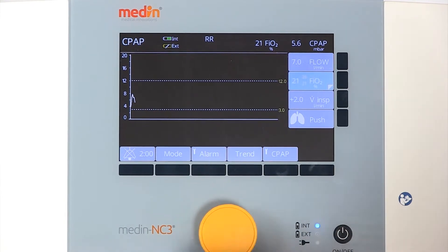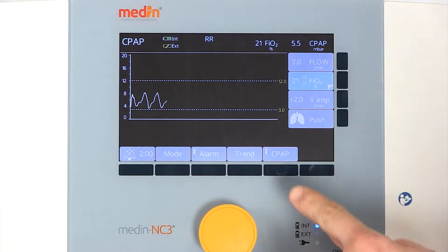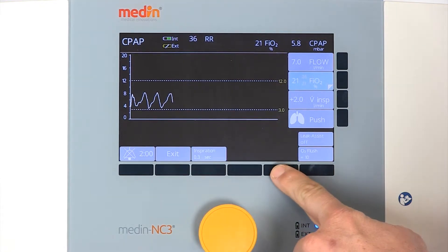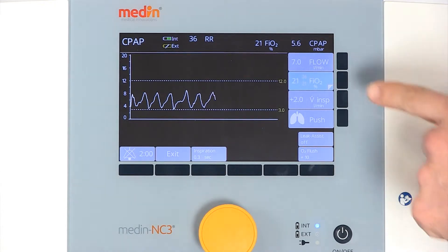The Medin NC3 offers a CPAP mode with an optional leak assist function. As in every mode, you can adjust the CPAP pressure using the basic flow.